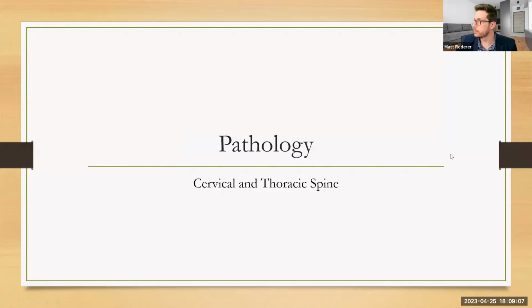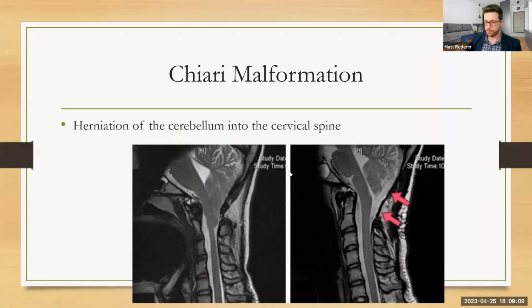All right. So let's look at this here. We have Chiari malformation. We kind of talked about that last week when we said we have that tonsil herniation. And this one's an extreme one. You can see this tonsil is coming all the way down here and pinching off right here. And this is swelling up very bad. This is starting to create that hydrocephalus.